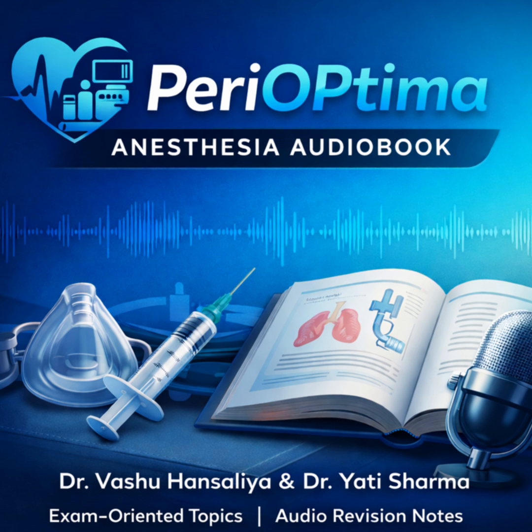Got it. Now look at the waveform itself. It's not just a squiggle. You have the systolic upstroke, the peak systolic pressure, the dicrotic notch. What does the dicrotic notch represent? Closure of the aortic valve. It marks the end of systole and the beginning of diastole. Good. And complications? Ischemia, thrombosis, infection, aneurysm, fistula, and the nightmare scenario, accidental intra-arterial drug injection. Absolute disaster. That leads to gangrene and amputation. You always label your lines.